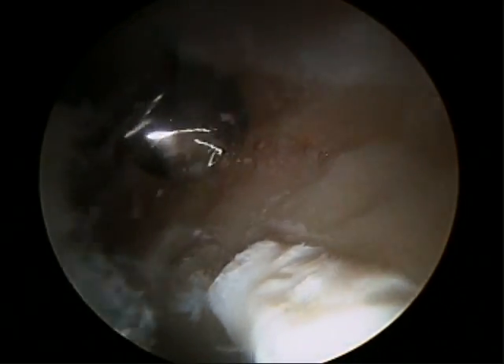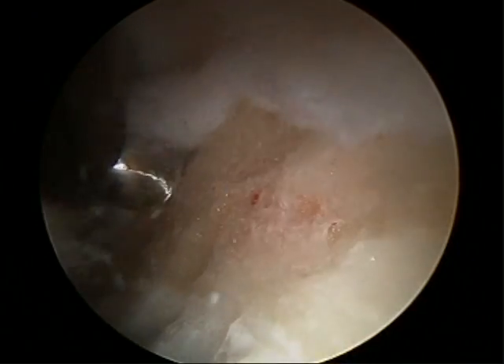Rim trimming is complete — we've gone through the whole anterior superior quadrant using the burr under fluoroscopic visualization and we've created a nice new rim to which we'll be able to reattach the labrum.